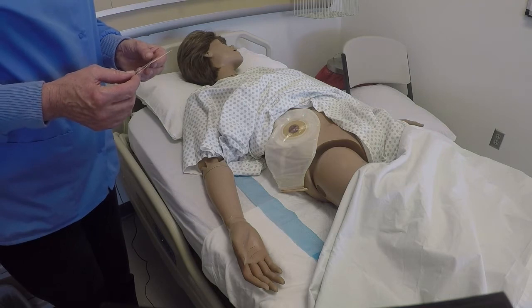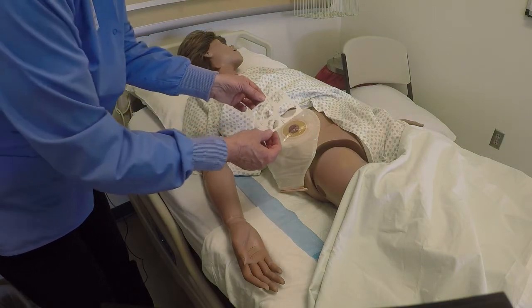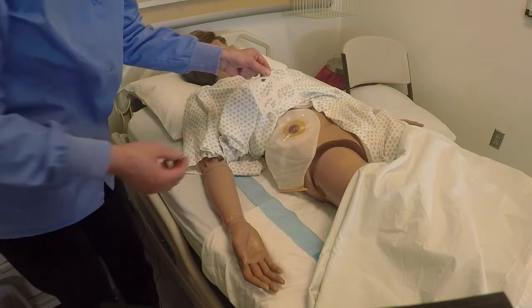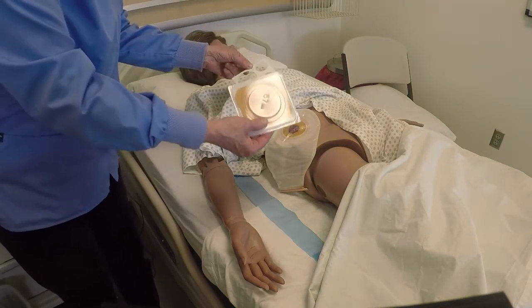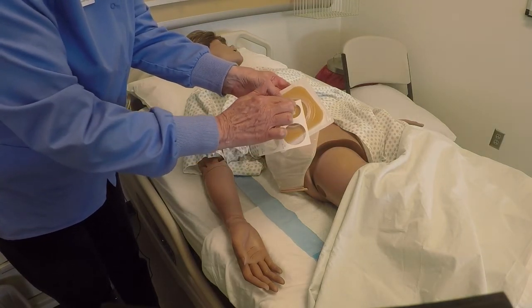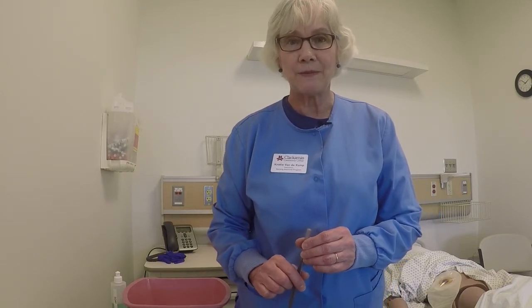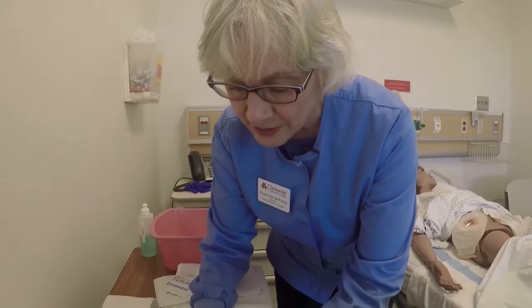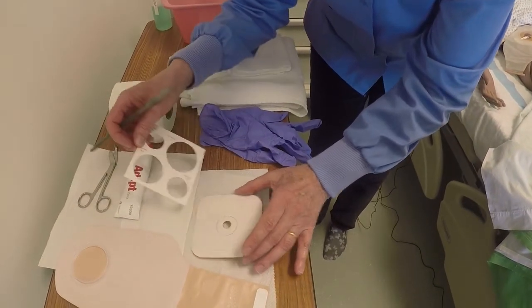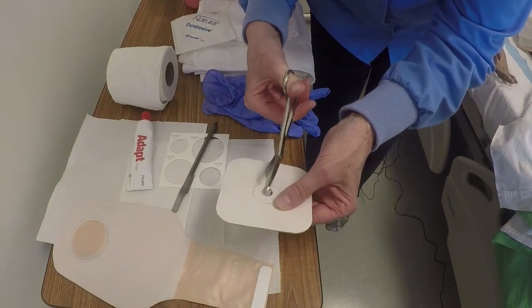C is to cut the skin barrier of the ostomy. We need to cut it so that it fits around the stoma. This is a stoma measurement tool that you can use to determine the size, because stomas come in different sizes and shapes. I determine the size, then get my skin barrier, and cut the hole so that when I put this barrier on, there's a hole that will fit over the stoma. Now that I know the measurement, I'm going to mark it on the wafer and cut it. I use a pin to get the size, then take my dressing scissors and cut the hole to be that size.